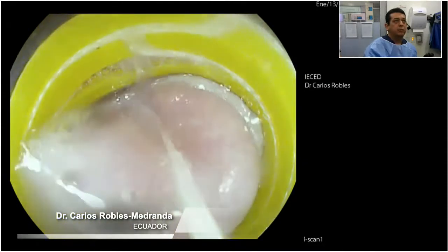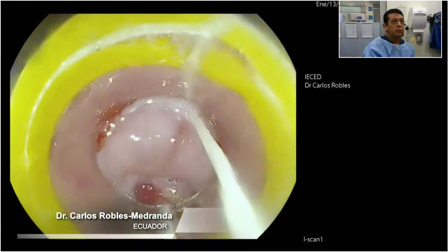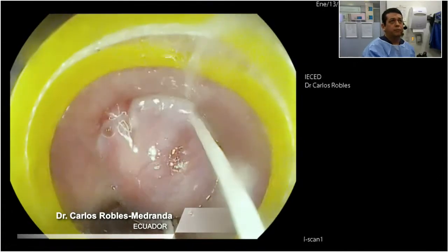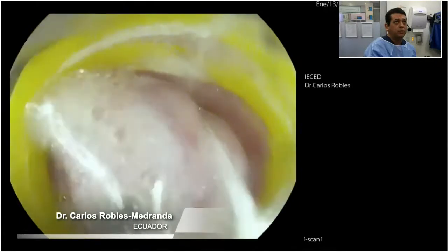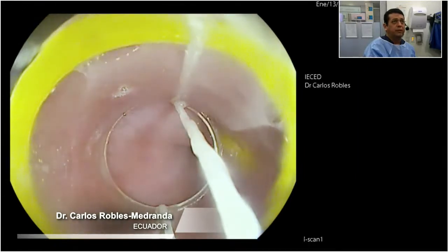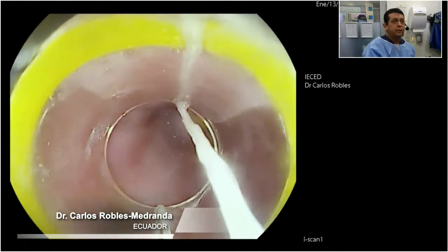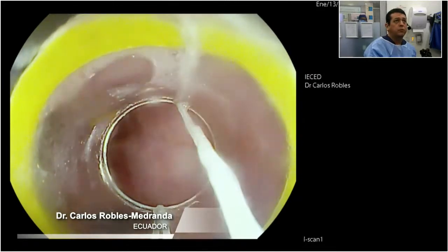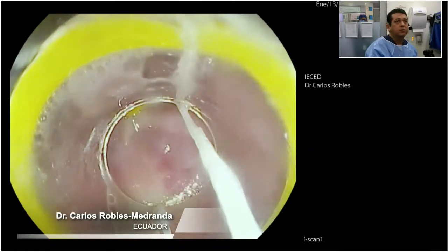It's very important to see where you will deliver your rubber, where you will perform the band ligation. Try to avoid the scars, it's very important. Except when you have a red spot over the varice, over the scar. In those cases, other treatment can be applied. So I think we are very good here. I don't have more varices. Maybe here.